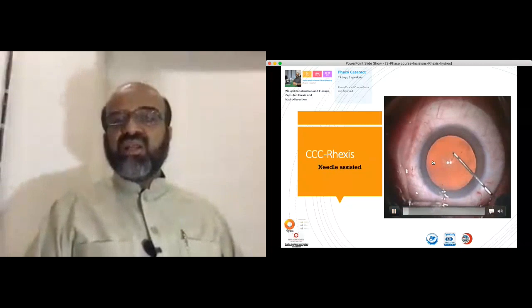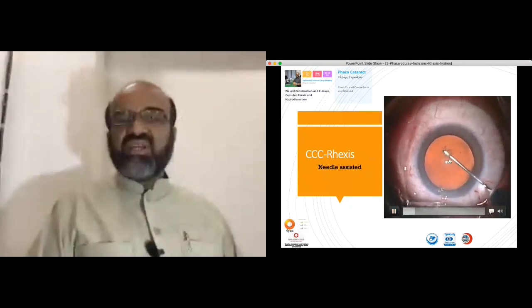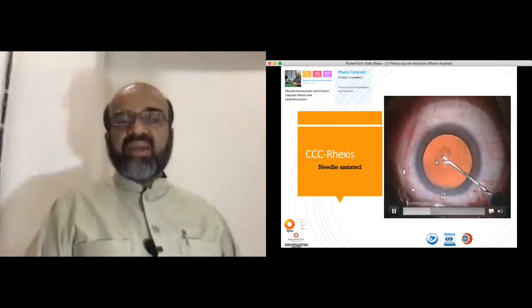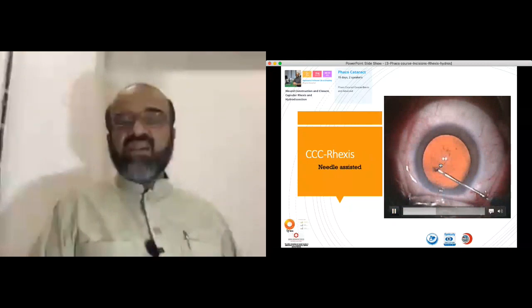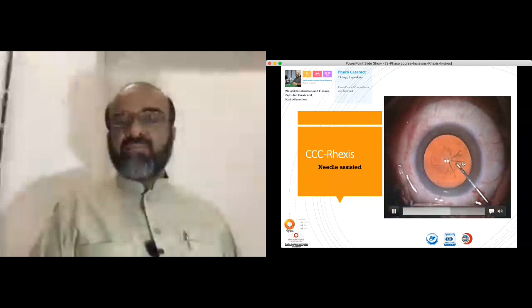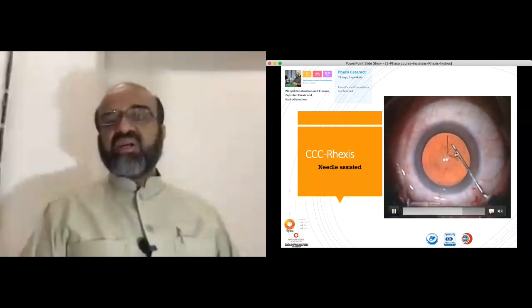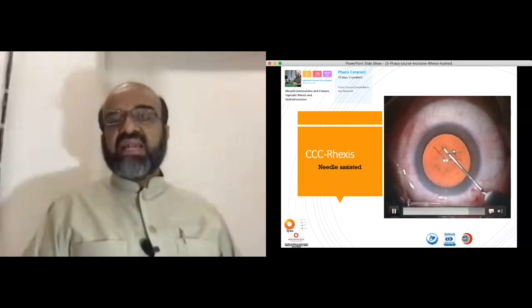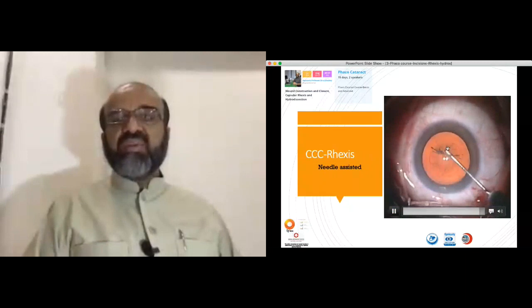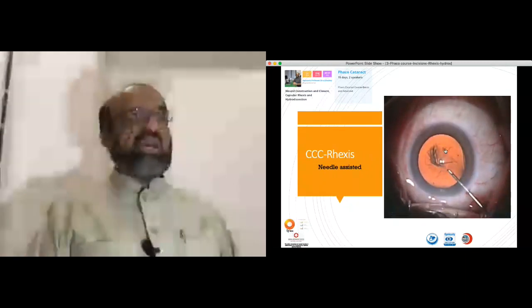So here is the needle. The first cut we have performed, that is the radial incision. Then we are raising the tongue, the flap, and rest of the touches are being made on anterior surface of the everted surface of the flap. And very gentle and great care is being taken that this needle never touches the capsular bed and remains away from the delicate bed of the capsule.